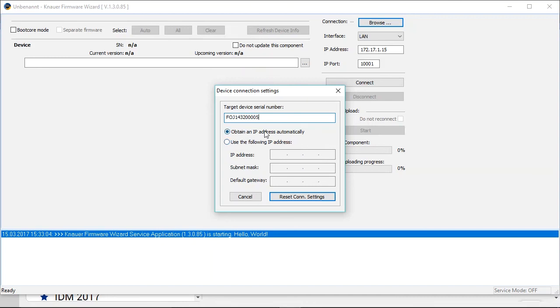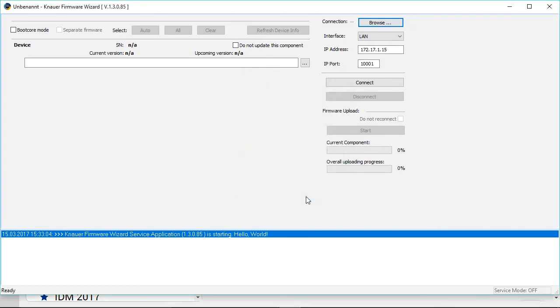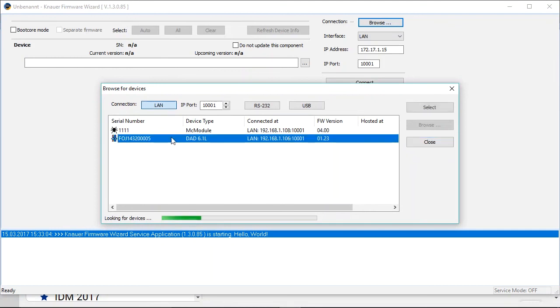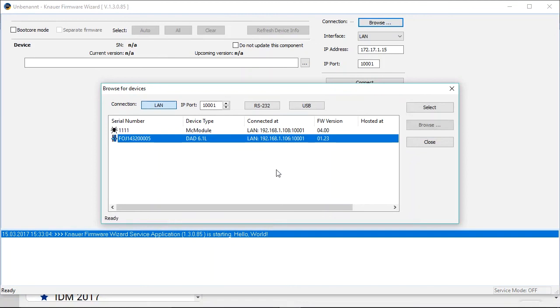In my case I will choose the DHCP protocol. And if this is done, you just click here on reset connection settings. And now the IP address was reset and we can browse again for the device. And as you see, we have here our detector with the IP address reset to the DHCP protocol.